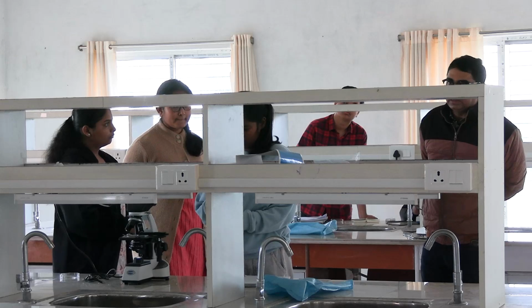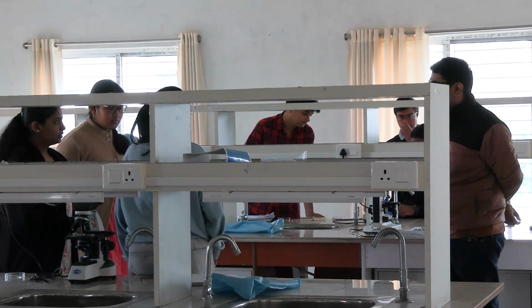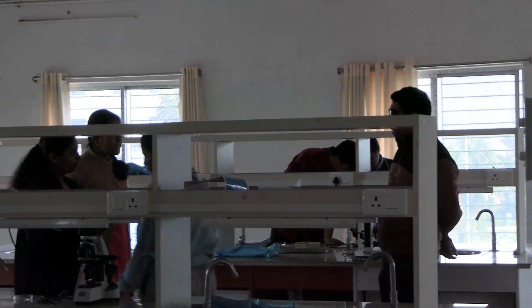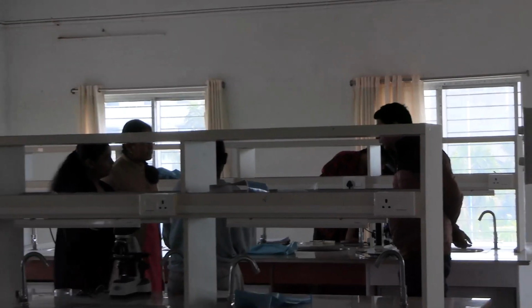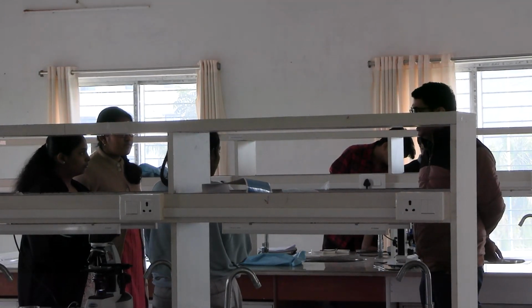That's why you are avoiding over counting. If you count every square, then in the next square, the RBC which is situated on the lines is counted double. This square and this square also, and the count is high. So you should always count the L pattern.